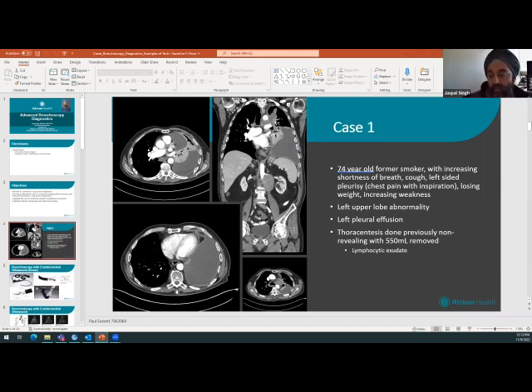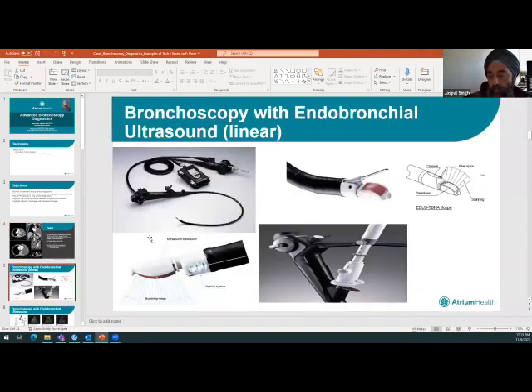So I'm going to give you a little idea. This patient, we were able to diagnose them by looking on the inside, and we're adding some technologies. And what technologies are we talking about? Well, a bronchoscope is usually a long camera, for those not familiar. But what's happened a few years ago is called the endobronchial ultrasound.